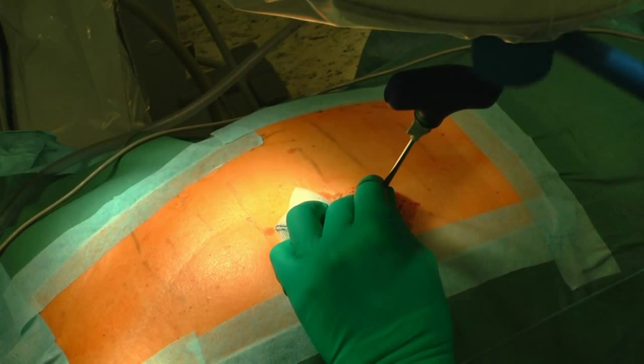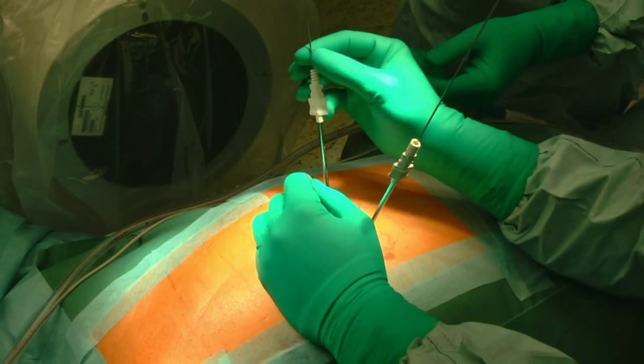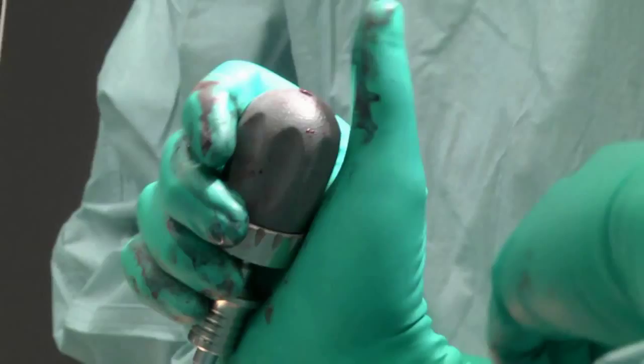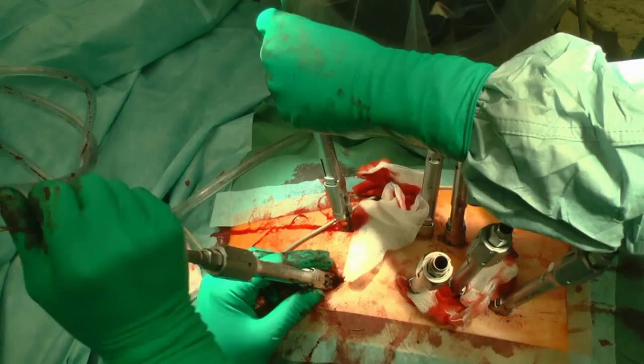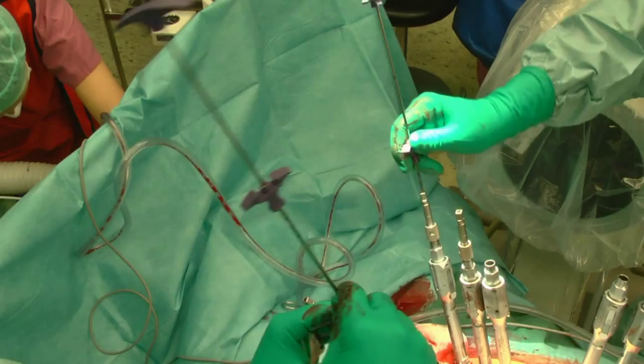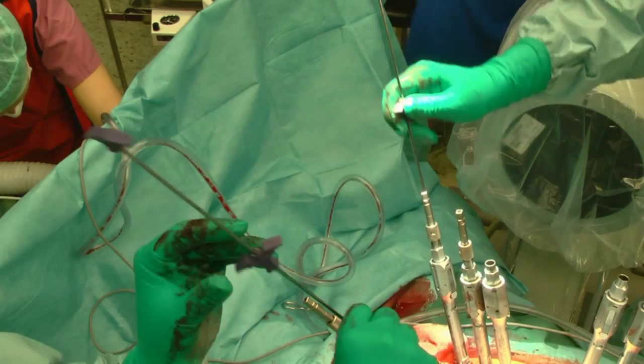K-wires are inserted into the vertebral body and the Jamshidi needles are removed and dilatators inserted. Screws are inserted from T7 to L1, excluding the fractured T10. All screws except T9 and T11 are augmented with PMMA under fluoroscopic control.